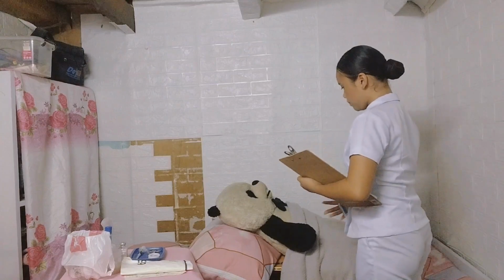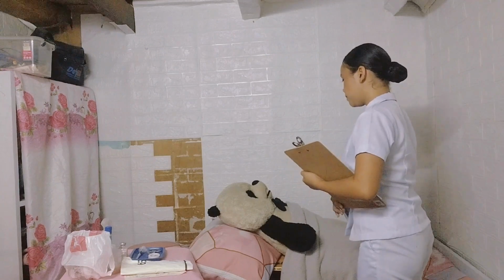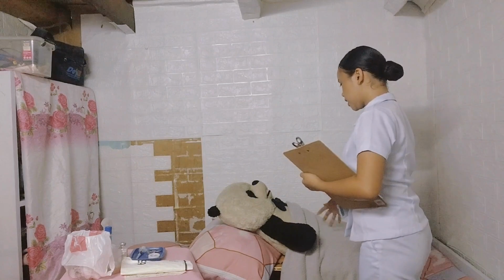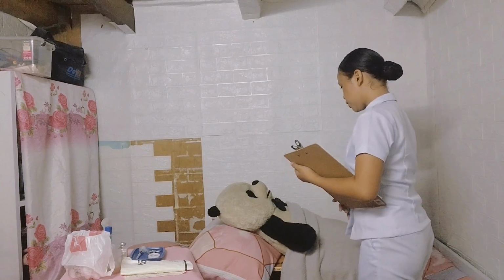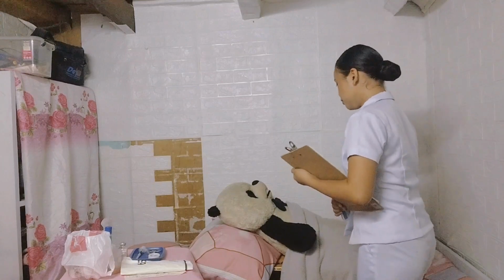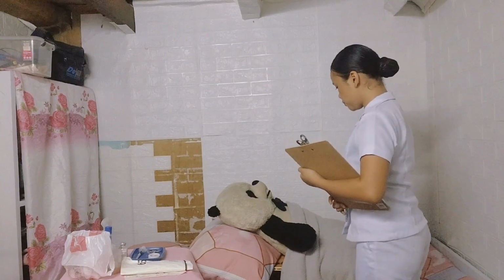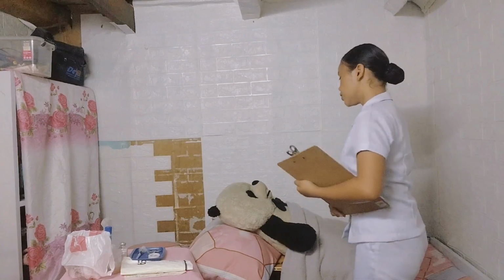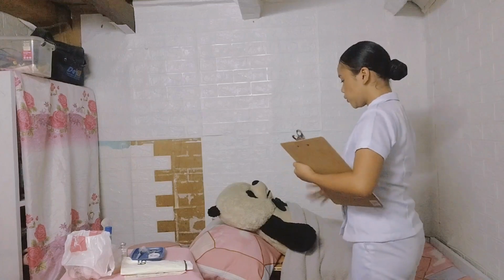Sir, the procedure that I will be doing today, because you cannot take the medication orally, is that I am going to give the medication to you through subcutaneous injection. While I am injecting, sir, is it okay that you won't move for a minute? Okay, thank you. Before we begin, do you have any clarification or concern, sir? Is it okay if I close the door so that no one from the outside will disturb us while we do the procedure?